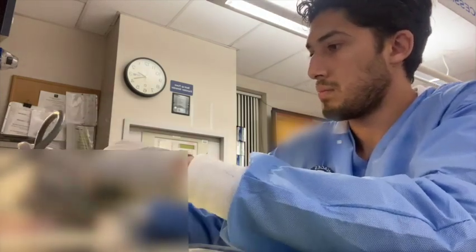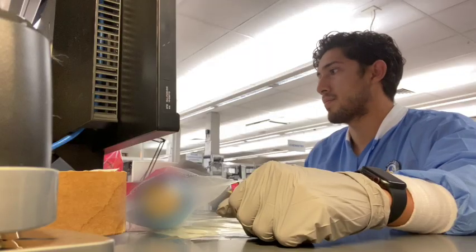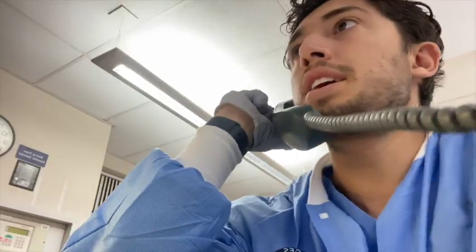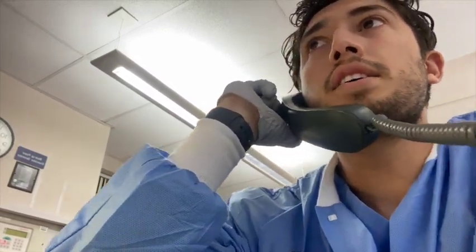A lot of times, specimen that is sent to the lab is no good. Either it's short or hemolyzed. And when that happens, it is my job to reorder it. And after I reorder it, I call the phlebotomist to let them know that the lab is requesting a redraw.